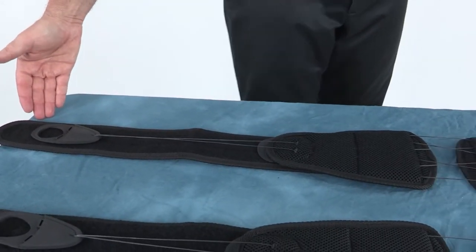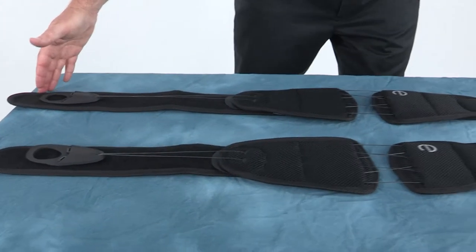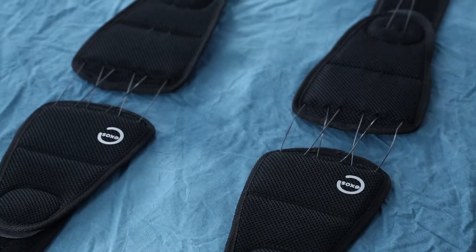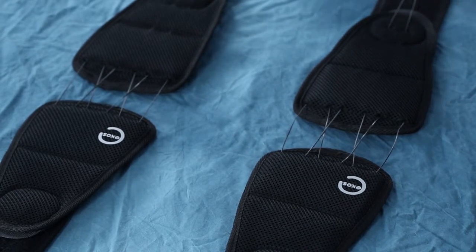The difference between the two belt sizes is the length of the belt wings. Formal instructions for measuring, sizing, and fitting the belt are contained in the instructions for use. However, fitting may also be done directly on the patient.